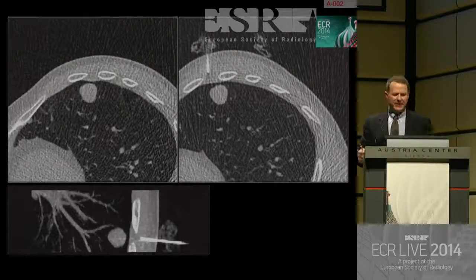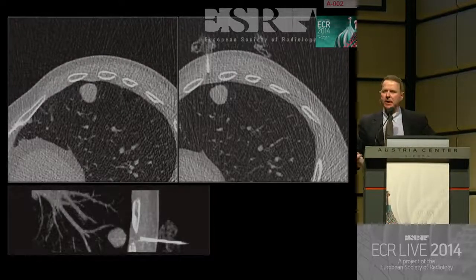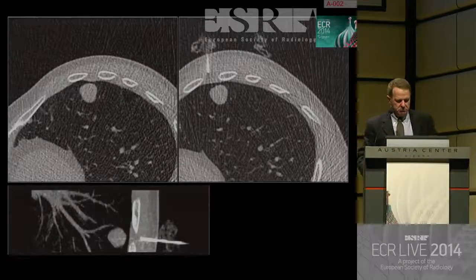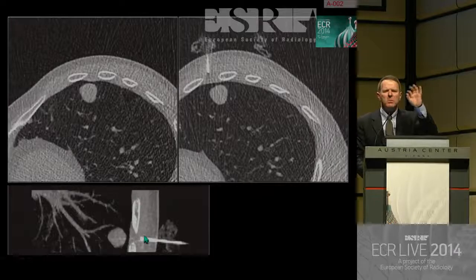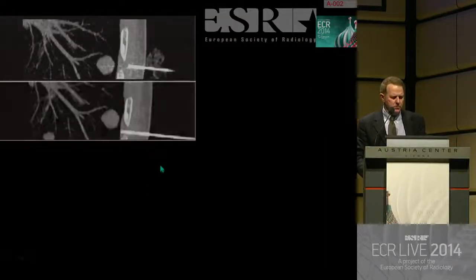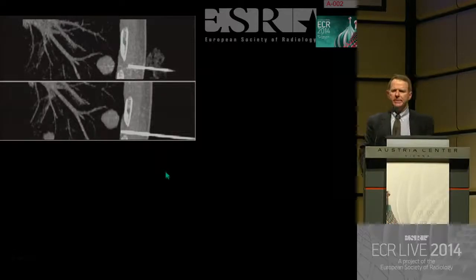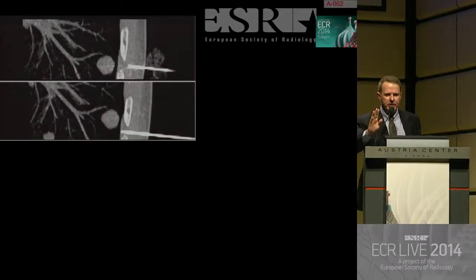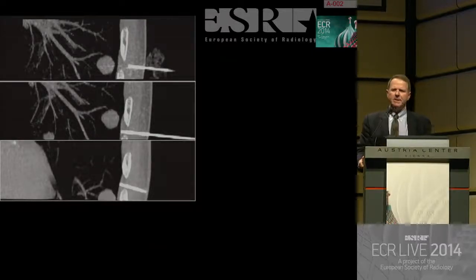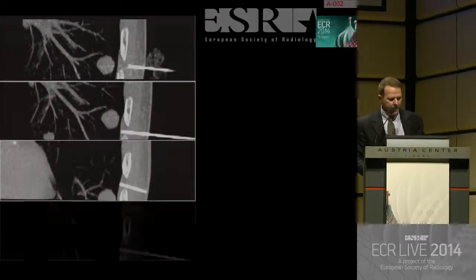Okay, breathing. This is an easy lesion, okay? You're there. Just in front of the lesion, you want to get a little more local anesthesia, a little bit more up to the pleura. Whoop. What happened? It's breathing less. Okay, sorry, sir. Again, take a deep breath, blow the air out, and hold it. Up. Too much. Okay, it's like a video game, you know?